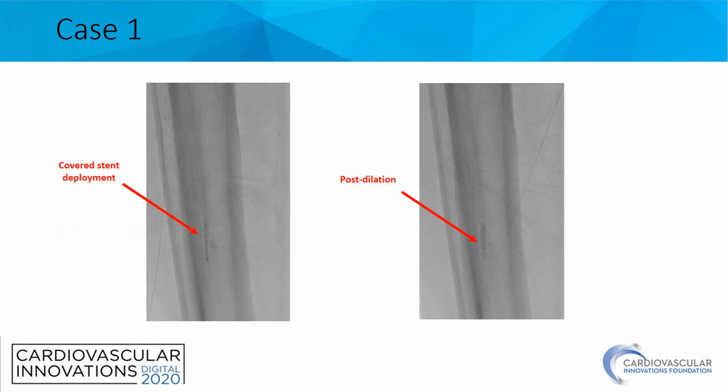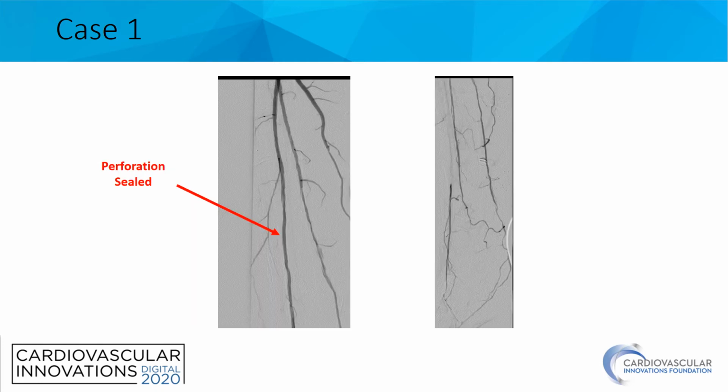We dilated it to nominal pressure. You can see it's very underexpanded. It took quite a bit of post dilation to get it to expand, but it finally did, and this was our end result here.